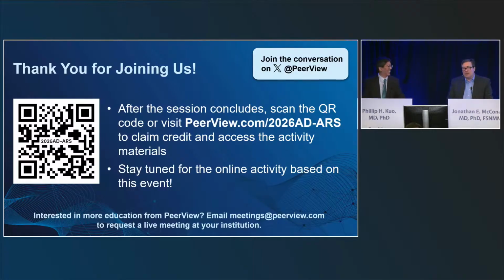But I think saying a Centiloid of 23 versus 25 is different is an error. Yeah. And really, to qualify for amyloid PET, of course you could get excluded if you have old hemorrhages. It's really just the visual. Yeah. You don't need a Centiloid. If you can't process the Centiloid score, you can just use a visual interpretation and qualify someone for amyloid targeted therapy. Absolutely. I think they're useful, but our clinicians want them, though they recognize there are some patients where we can't do it or there are issues. And you don't have to have that to make a correct interpretation.